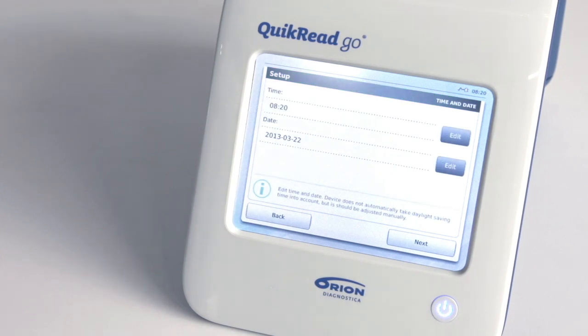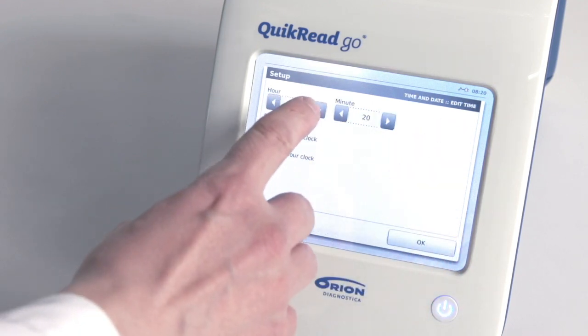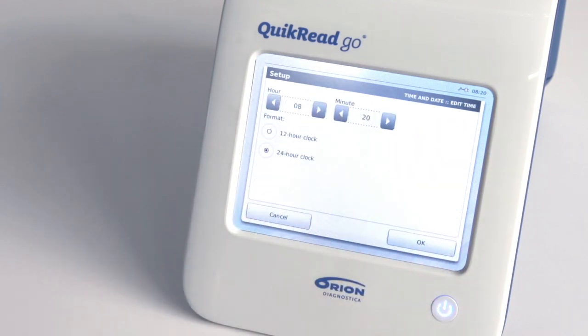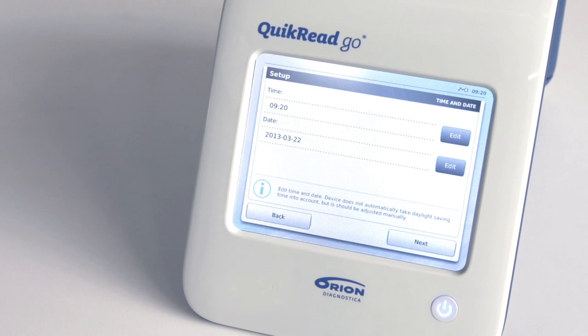The second step in the setup wizard is to adjust the date and time. Choose Edit on the time row and adjust the time with the arrow buttons. Select a 12-hour or a 24-hour clock according to your needs. Confirm your settings by pressing OK. You can edit the date with the same procedure and accept your settings by pressing OK.